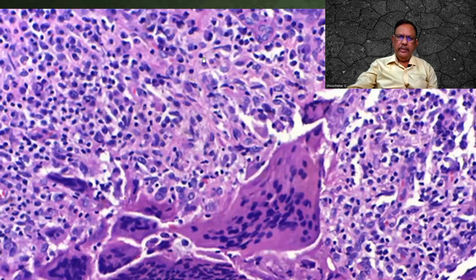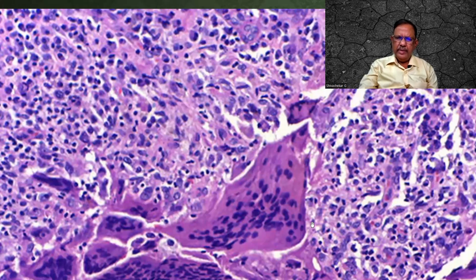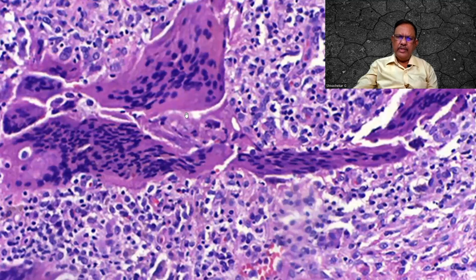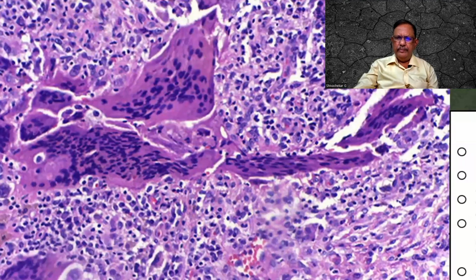Look at this one. These are all the lymphocytes. There is a nucleus eccentric and this can be a plasma cell. A plasma cell is probable, and this is a large giant cell that I am seeing. There is an aggregation. Some of the cells are all pale. They are all probably the macrophages over here. So foreign body type of giant cells, macrophages, lymphocytes, I can make out easily.